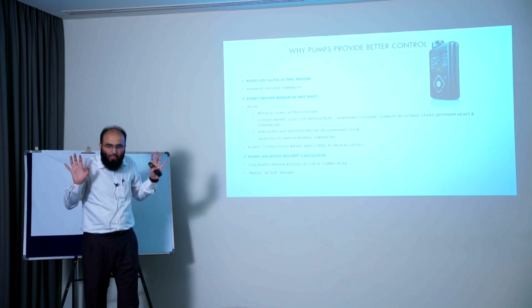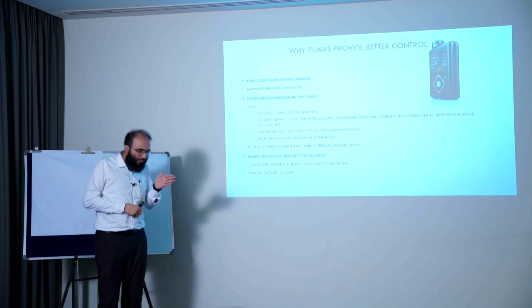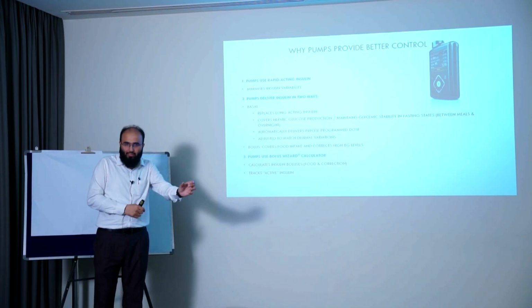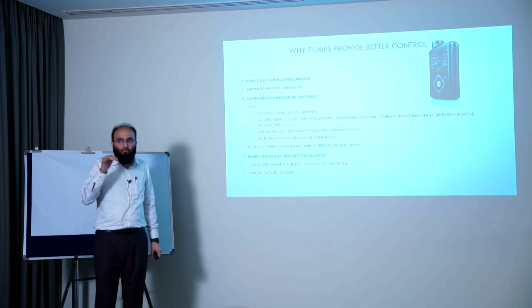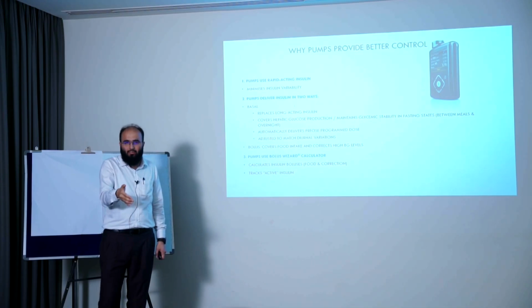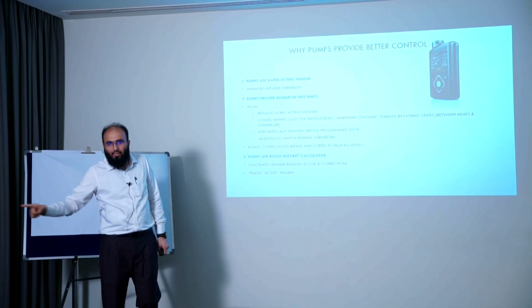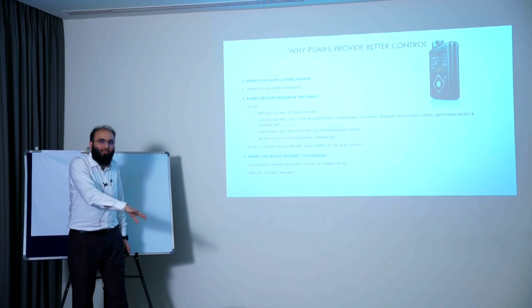You just have to tell it, I am taking 100 grams of carbohydrate. And it sees how much the glucose is now, what target I want to achieve, how much active insulin is there right now, and what additional correction should be given. And accordingly it gives. Now suppose there's a risk of hypoglycemia. Then the automated pumps reduce your bolus dose by 25%. And then it predicts whether this patient will potentially have hypoglycemia or not. If there's a risk of hypoglycemia, it will further reduce by 25%.